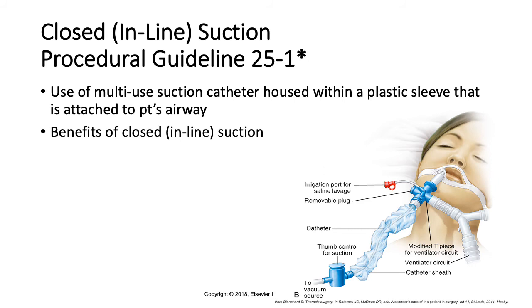Some of the benefits is that there's a decreased risk of hypoxia and some of the cardiovascular complications as when compared to open suctioning, because you will not have to interrupt ventilation and oxygenation from the ventilator in this critically ill patient. So that's really important. It's a quicker procedure because it's not sterile.